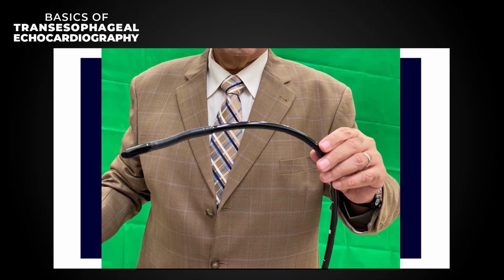Muhammad Abdul Latif asks, could you please tell us the steps for a complete study, regardless of the order of views? I usually start with the mid-esophageal view, and I sweep my angles from 0 to 30, 60, 90, 120, and at 180, I see the mirror image.